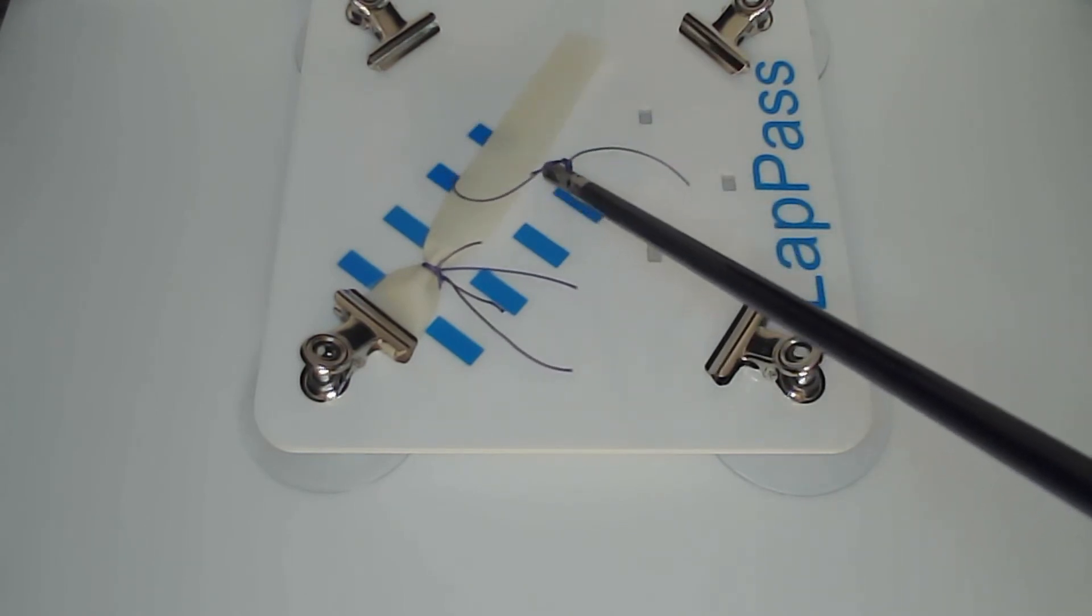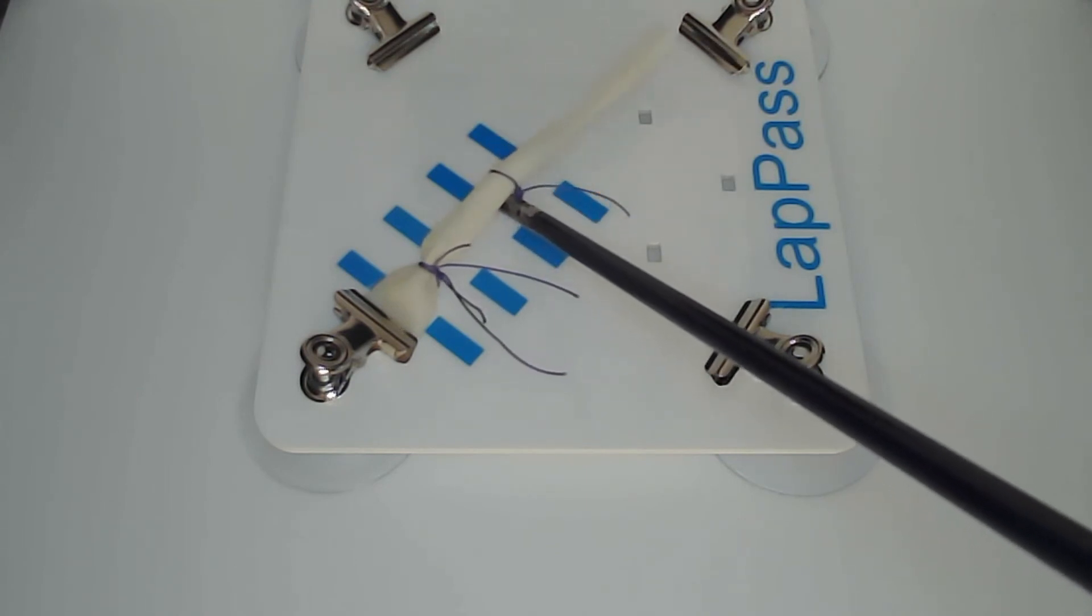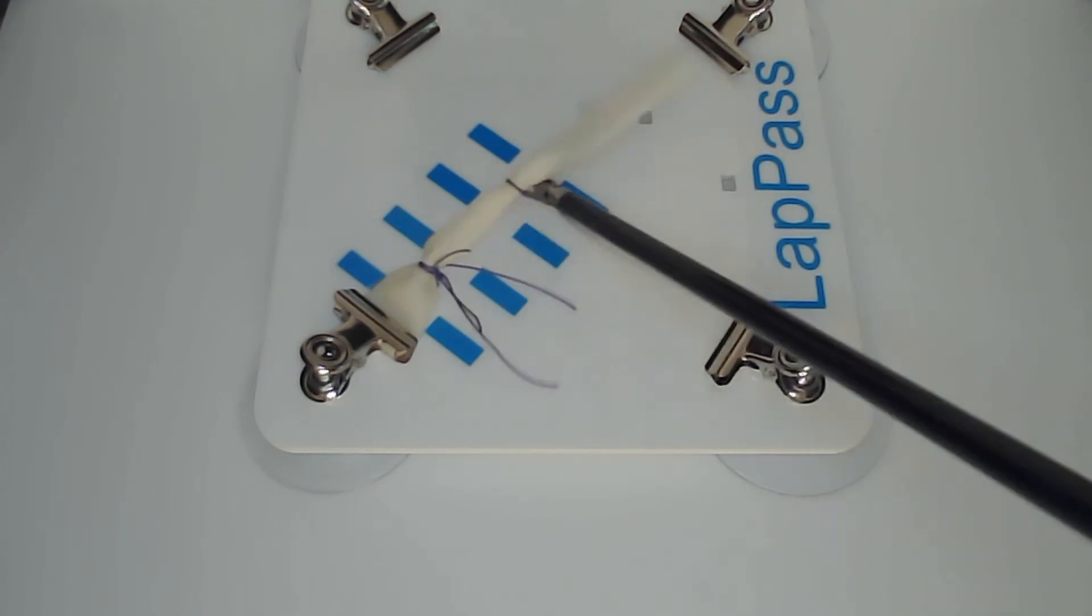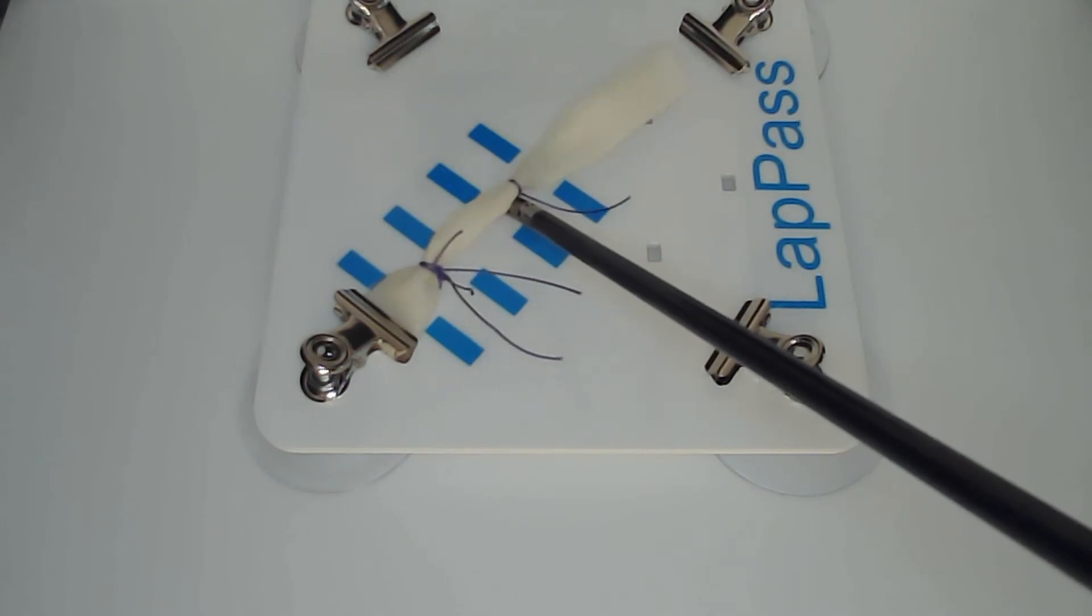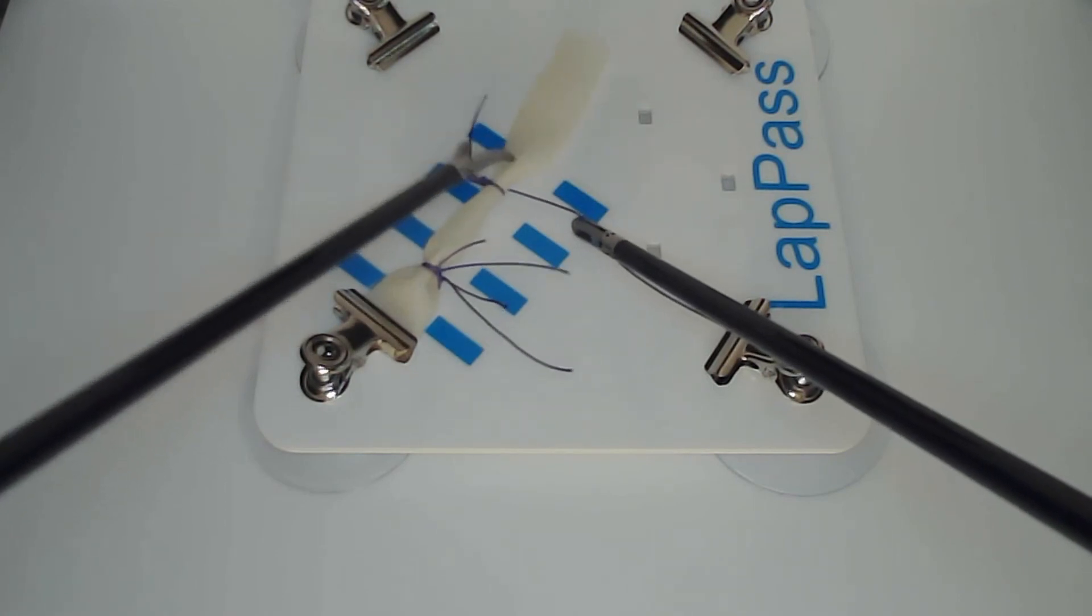You need to pull on the end to knot it properly within the appropriate zone, and then pull in a perpendicular fashion with your remaining instrument just to lock the knot in position.